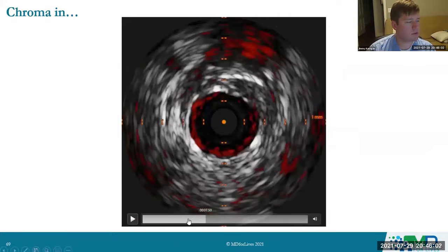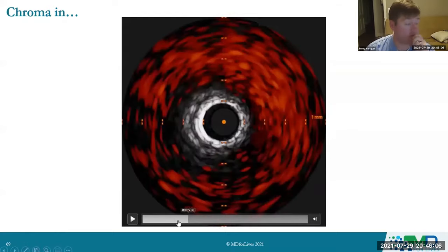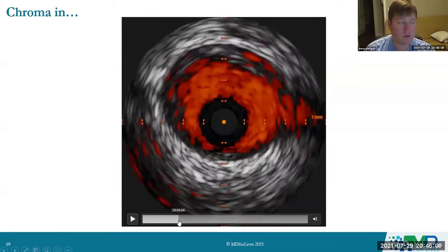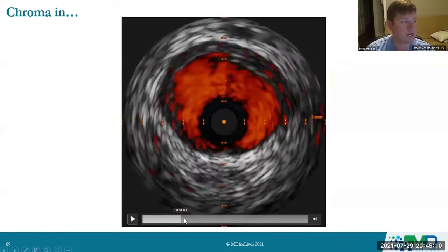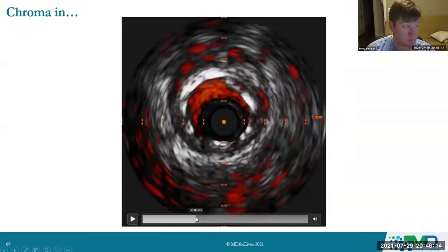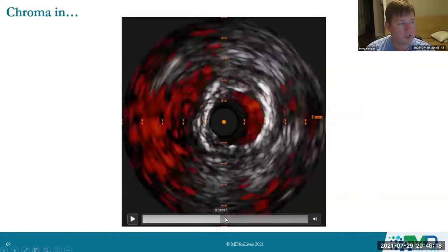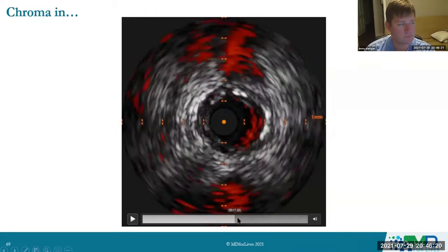So distally, the proximal stent edge looks fine. The left main is there, the circumflex is coming in, no evidence of dissection in the left main. I do use aggressive guides for support, so I do check that usually. And then as I'm going in, the proximal stent edge is underexpanded, so that gets touched up later. And I'm looking for any flow outside of the stent.